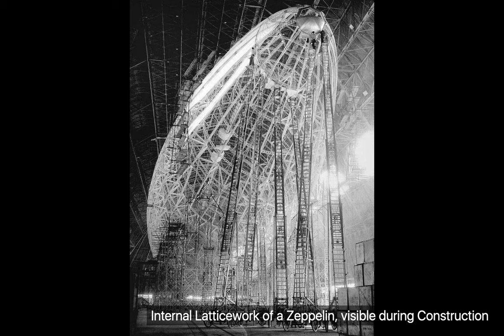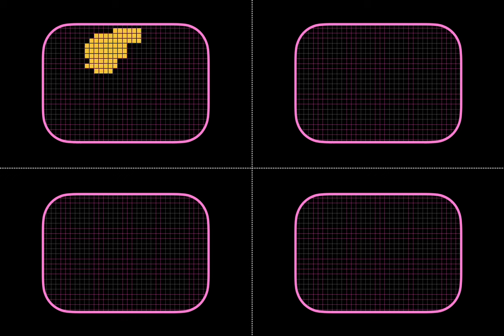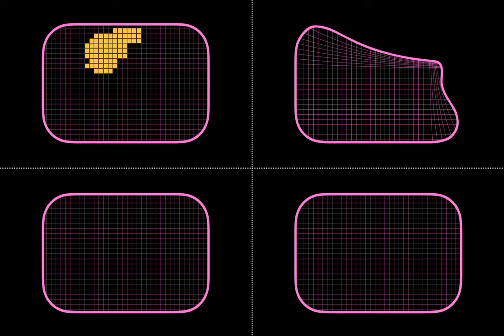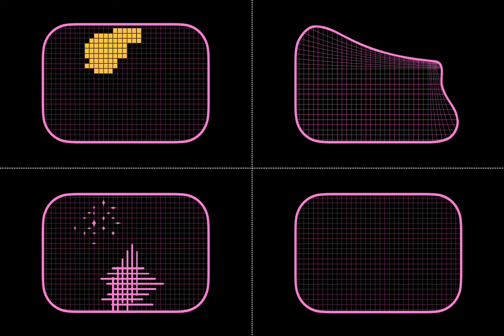If I were to draw a simplified representation of the lung, I'd choose to draw it like this. Whenever you encounter an abnormal lung opacity on a chest x-ray, think of four possible causes: the gas in a region has been replaced by fluid; the gas has gone away and the area is focally deflated; the fine latticework or interstitium has become thickened, either regionally or very focally; or a solid lump has developed within the lung.